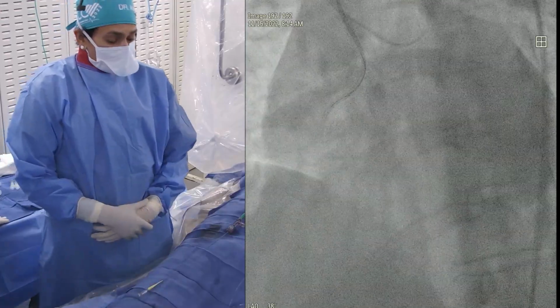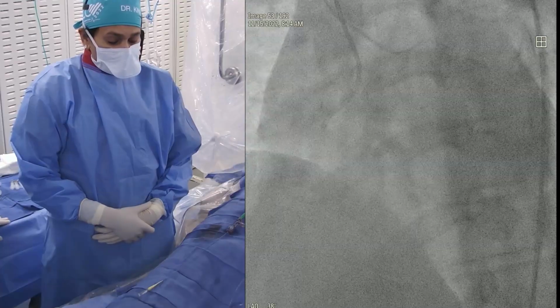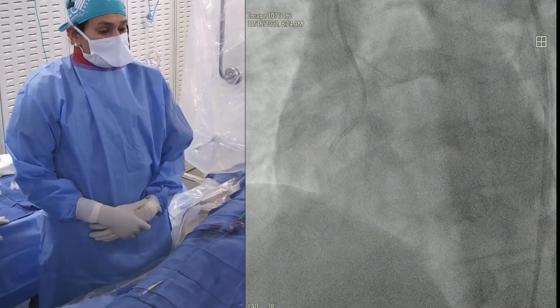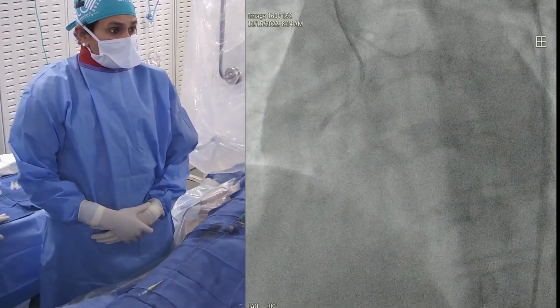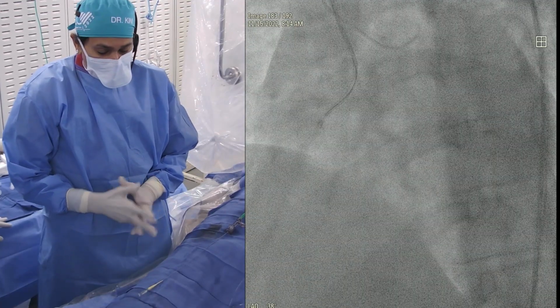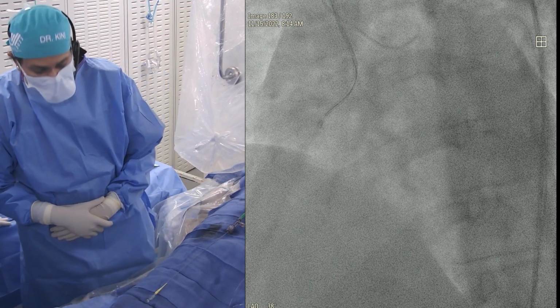Then going to the microcatheter, which we definitely teach, we will try antegrade first with a soft tip wire, and then we will gradually escalate with the other wires, and we will discuss the wires as we are going through. Then microcatheter, again, we are using FineCross, but you could use a Corsair or Turnpike, whatever people are comfortable with.